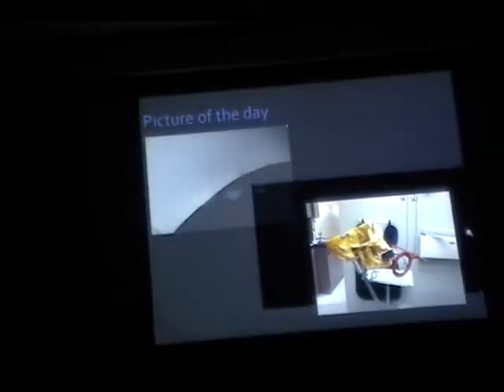So let's zoom. The receptor is not in the mouth, you're taking an exposure of the back of the receptor. Can you speak a little louder so that everybody can make a note? The receptor is not in the mouth and you're taking an image of just the back of the receptor. And the other thing is whether the receptor is facing correctly or not. The receptor has to be in the patient's mouth first. It's outside.